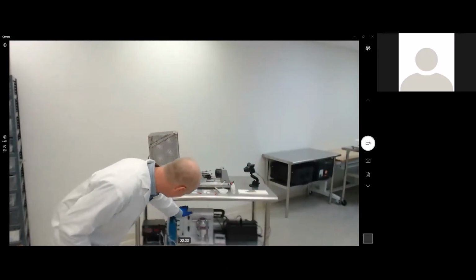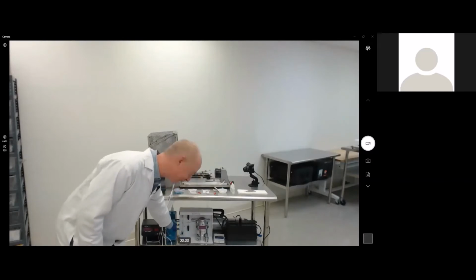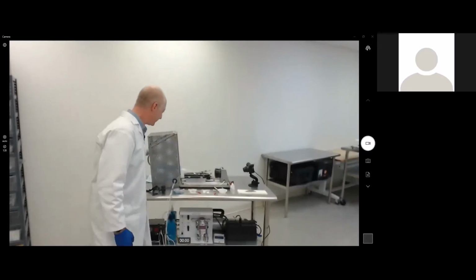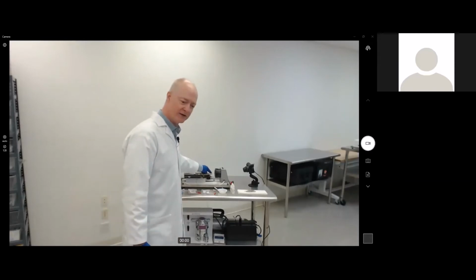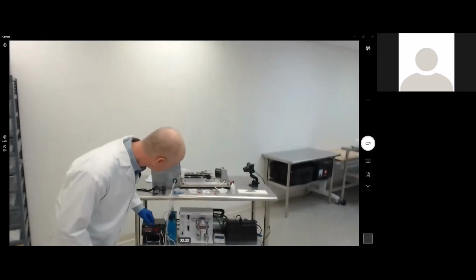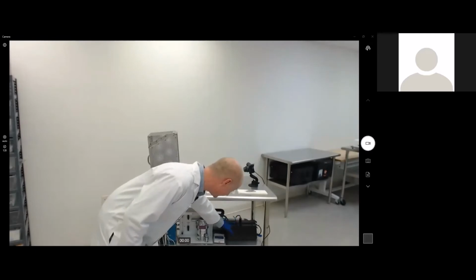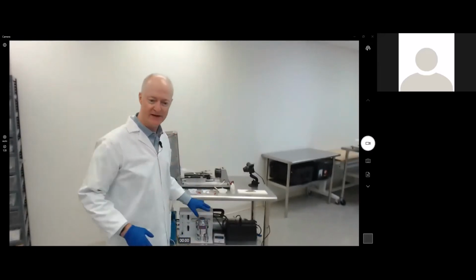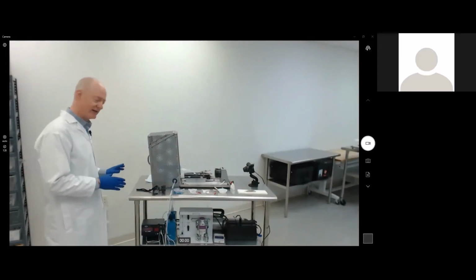And then secondly, we have over here our Xenotech isoflurane anesthesia system and the appropriate charcoal filters so that we're able to sedate the mouse over here in our little acrylic induction box, but also keep them asleep in our face mask that's built into the table. Over here, we have the oxygen supply, as well as an APC. So we're actually running independent. We're not connected to any of the electrical mains. It's all being isolated in that manner.